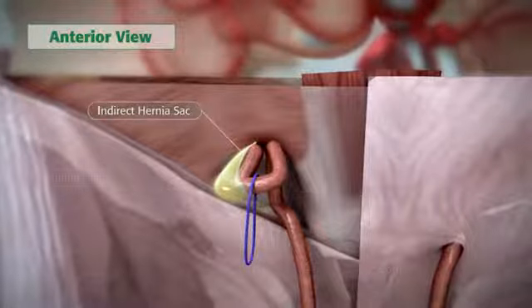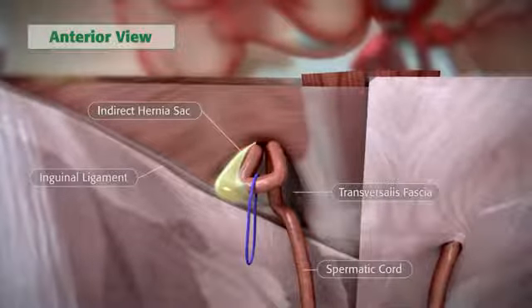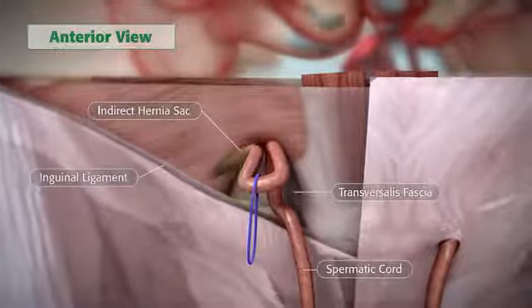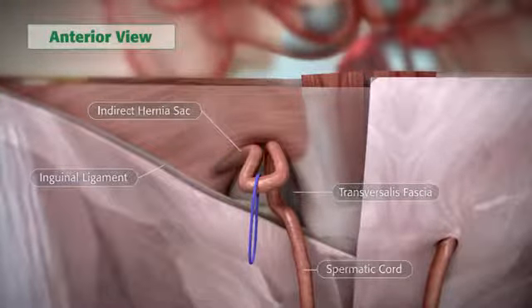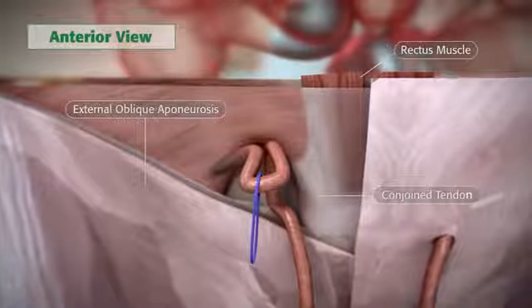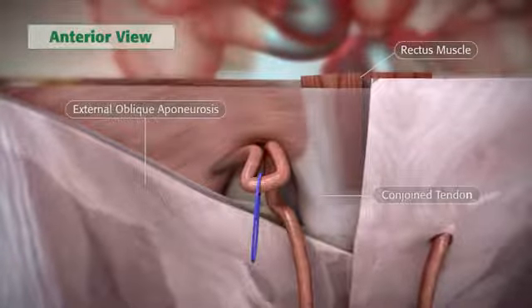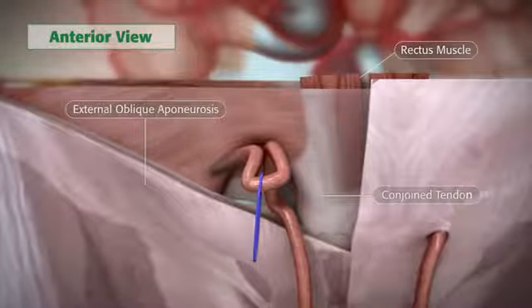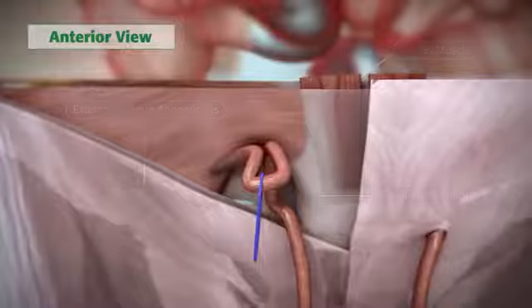If an indirect hernia is identified, reduce the sac and contents and ligate or remove the excess sac as appropriate, according to general surgical practice. If a direct hernia is identified, it will be repaired with the placement of the Polysoft hernia patch. In the case of a direct hernia, always ensure there is no indirect hernia present.